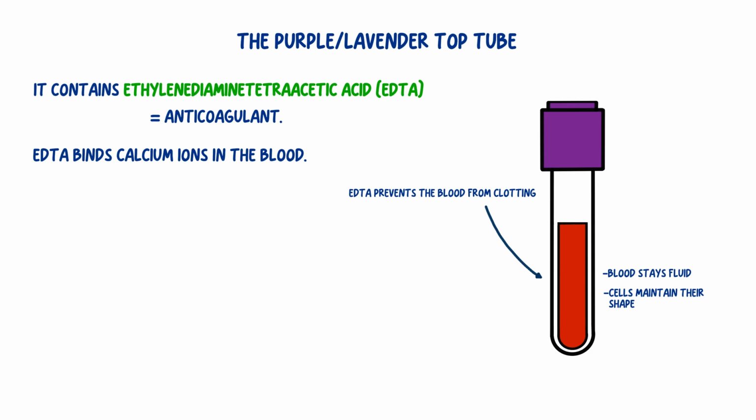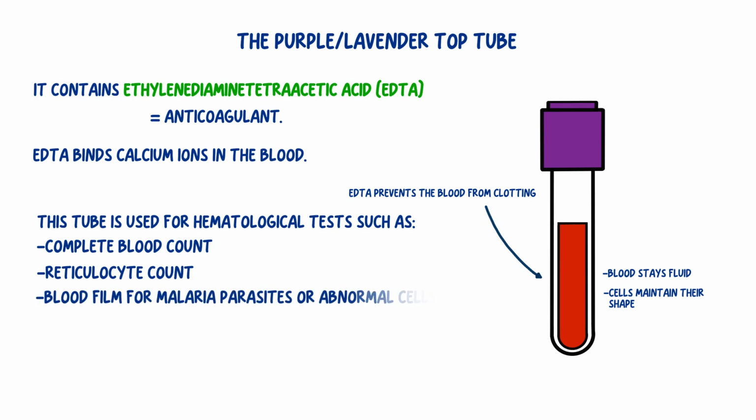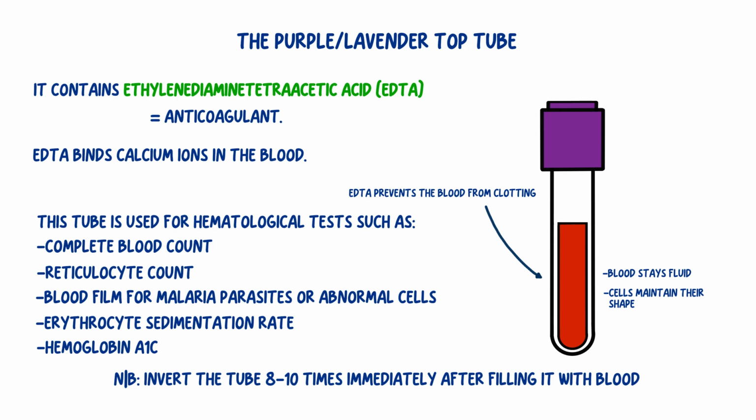The lavender or purple top tube is primarily used for hematology tests, such as complete blood count, reticulocyte count, blood film for malaria parasites or abnormal cells, erythrocyte sedimentation rate, and hemoglobin A1C. Remember to invert the tube 8 to 10 times immediately after filling it with blood to ensure thorough mixing and proper anticoagulation of the specimen.